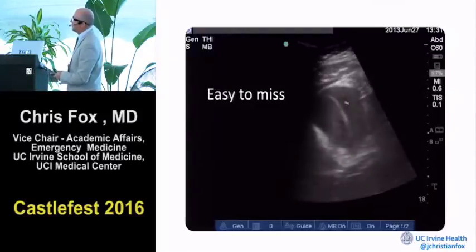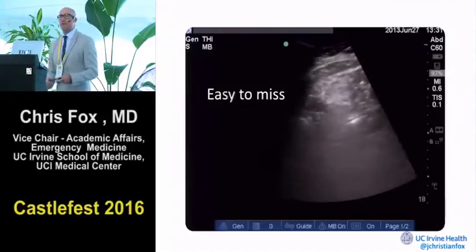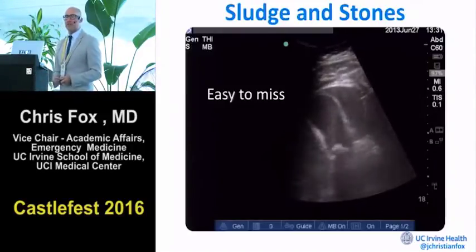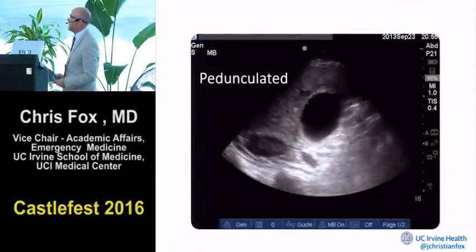That's QA. But this is actually a gallbladder. This turns out this is a gallbladder right here, okay? And this is the liver over here. And this sludge can be very isoechoic with the liver parenchyma, and you could miss that sludge somewhat easily if you're not careful. So just keep that in mind. And this is a stone somewhere. It's hard to project right there at the end of that clip. It's down towards the neck.